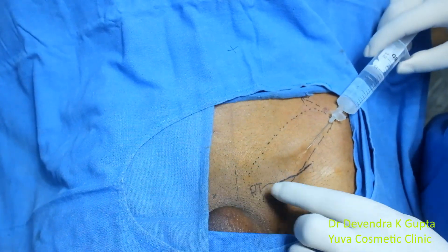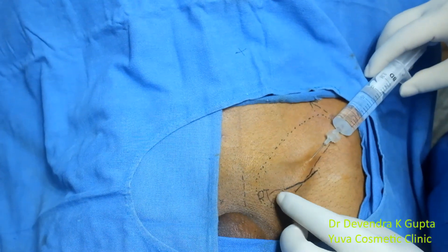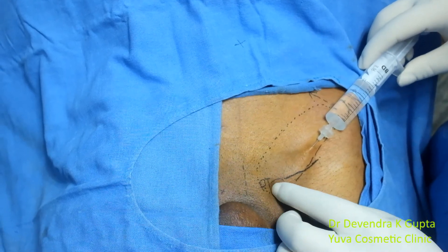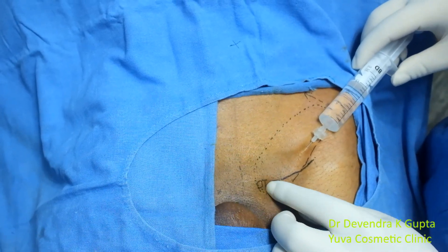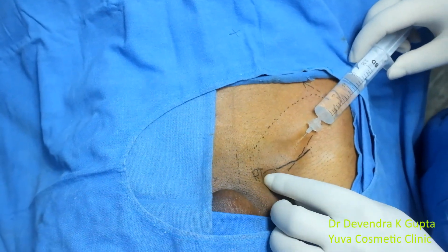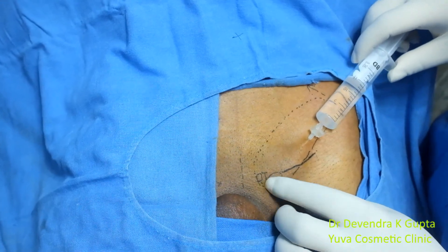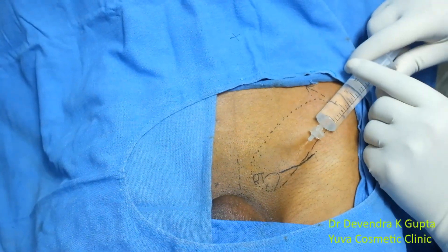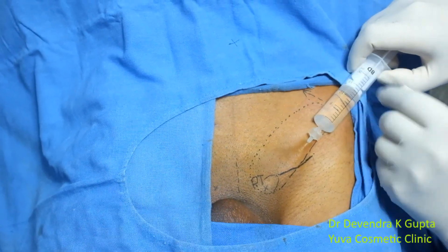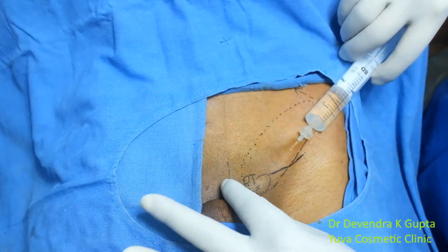Advance the needle towards the external ring carefully, otherwise a hematoma will form. Palpate the tip of the needle and inject 3 to 4 ml of solution to block the genitofemoral nerve. Again, aspirate and then inject — aspirate then inject, because this is a very dilute solution.